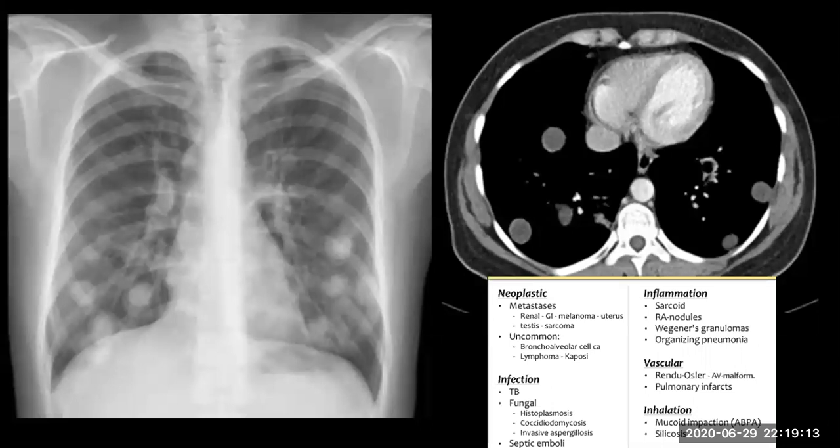And this is hydatid cyst, by the way. Yes, because it is hypodense and non-enhancing. Yeah, it is hydatid cyst in this patient, okay? Any question?